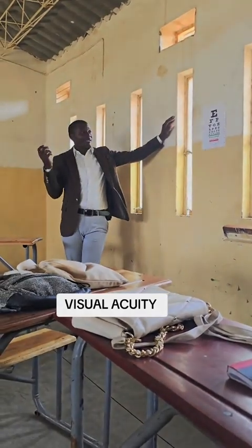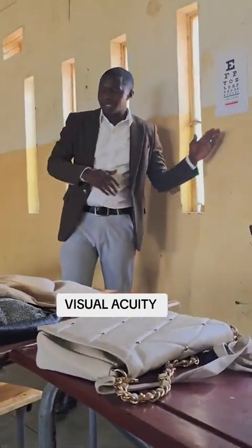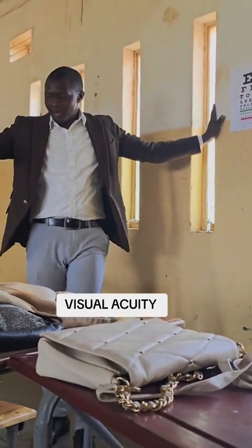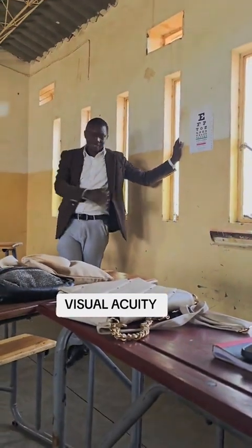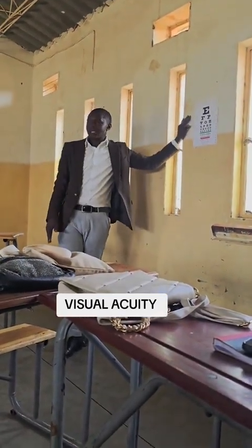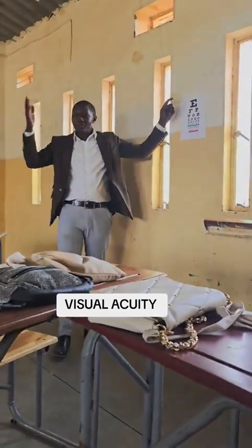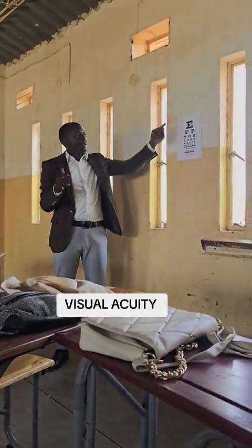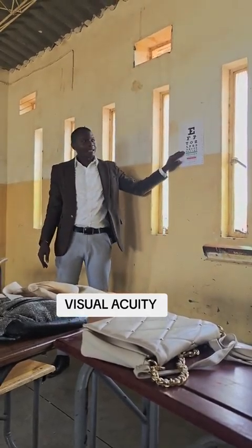Recording on the Snellen's chart. You normally tell the patient, you count 6 meters first of all from the chart. All the way you count 6 steps, then you tell the client to stand or sit 6 meters away from the chart. Then from there you tell the client to cover at least one eye using the palm. And then they mention the letters that they are able to see as you point on the chart.